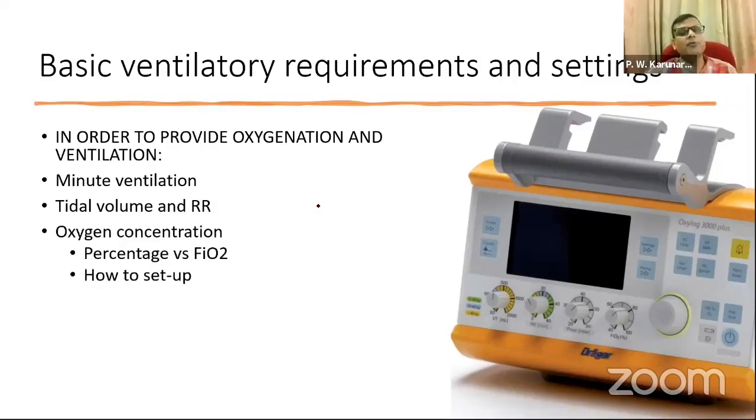Now you have selected a mode and a certain minute ventilation in your mind, and then you set a tidal volume and a certain rate. You don't have to be exact. You can always evaluate the patient and then adjust the settings.